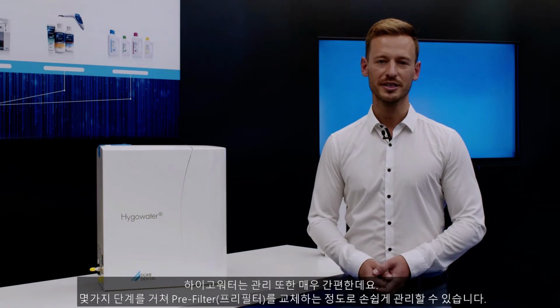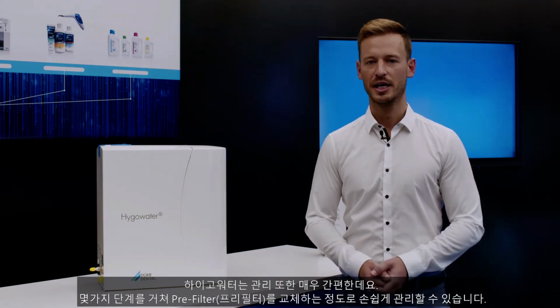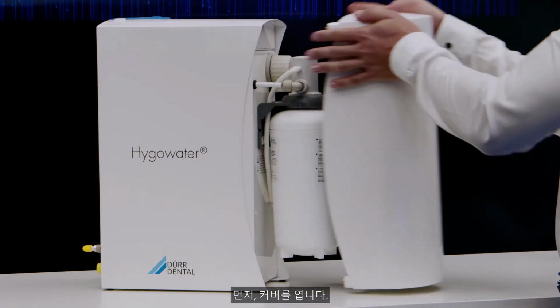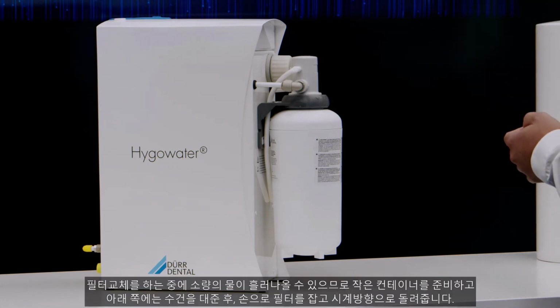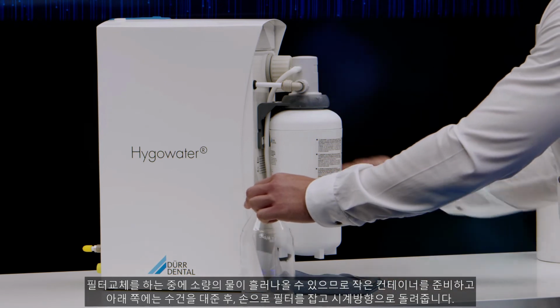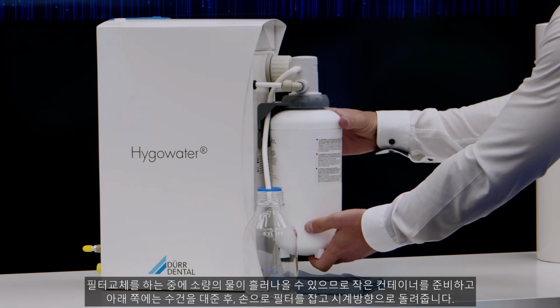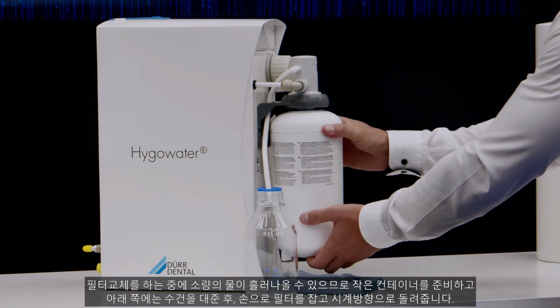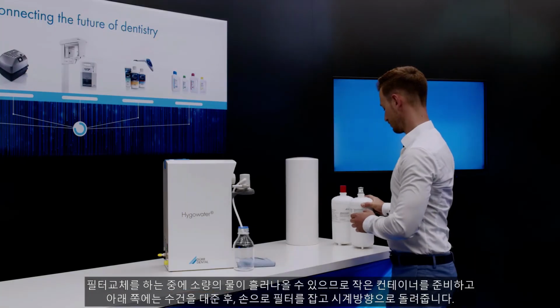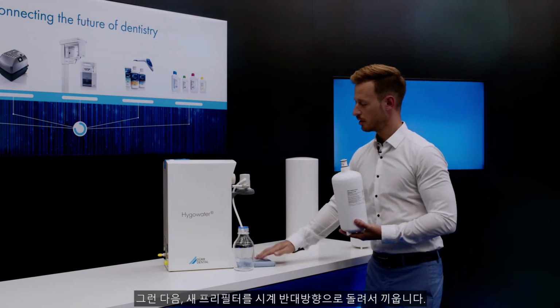Maintenance requirements for the Hygowater are minimal. As the operator, all you will need to do is replace the pre-filter. This is something that only takes a few simple steps. First, we take off the front cover. A small amount of water will escape during the replacement process. For this reason, we recommend placing a cloth underneath and keeping a suitable container ready to hand. Unscrew the pre-filter in the clockwise direction to relieve any pressure still present in the system. Then simply screw the new filter into the system.